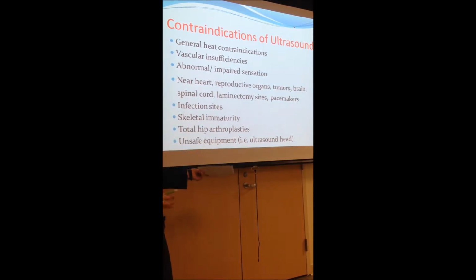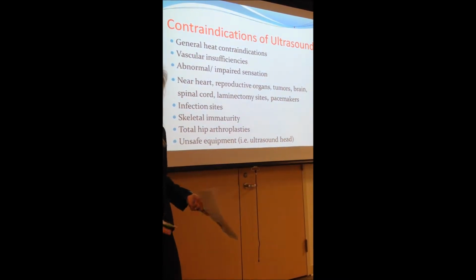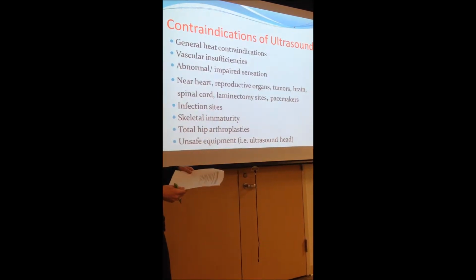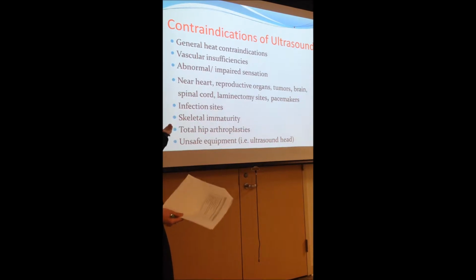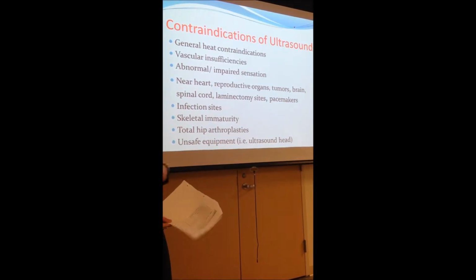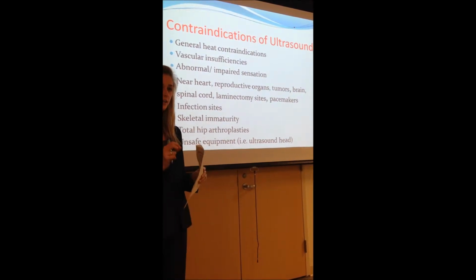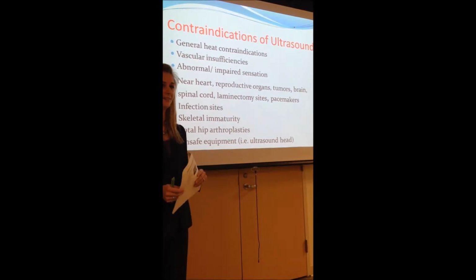Pacemakers. It doesn't mean someone with a pacemaker can't have ultrasound applied to them, it just means it can't be over the pacemaker, so it can be at a more distal site. Infections, obviously we don't want to spread them. Skeletal immaturity, total hip, not a good idea. And any sort of unsafe equipment. So if your ultrasound head isn't working correctly or there's a hot spot, it's a good idea to get that replaced.